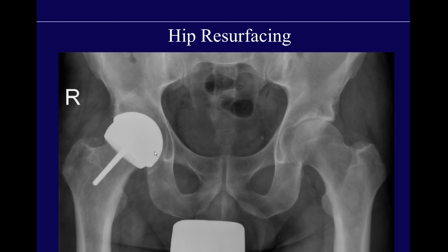Hip resurfacings also replace both sides of the joint. They're typically done in younger patients with degenerative arthrosis. On this patient's contralateral left side, you can see degenerative joint narrowing in the setting of a CAM-type configuration with resultant femoral acetabular impingement. These younger patients will unfortunately need hip revisions, so a hip resurfacing preserves bone stock so that later in life they can have a total hip replacement and still have a lot of bone remaining.